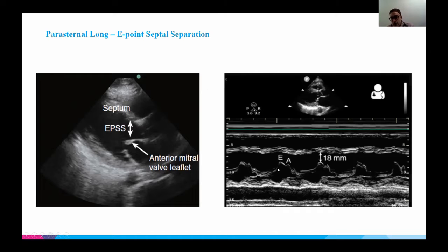So this is sort of the distance we're measuring in our M mode setting. And you can actually see these sort of peaks and troughs. This is just the movement of the tip over time. And then this layer here is a septum. And so here the distance measured is 18 millimeters. So this would be a patient that I'd be worried might have reduced LV function. And then from there, I'd probably use some other cardiac views to try and see whether I'm right or wrong.